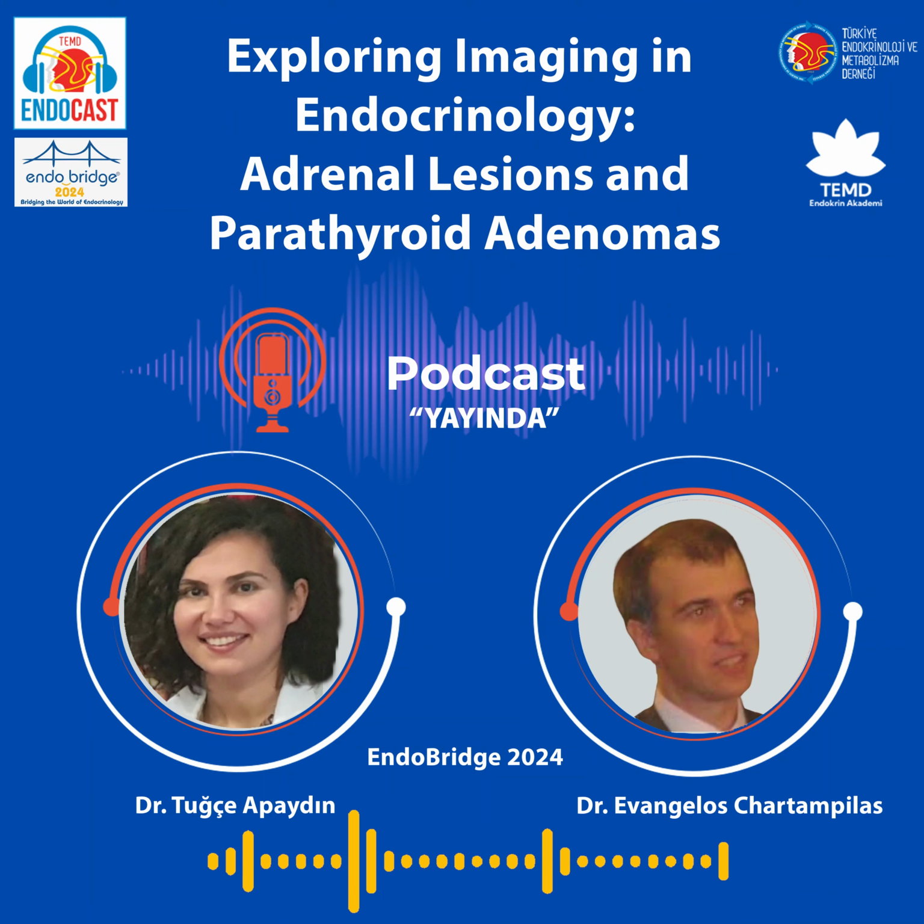Now, things are getting more difficult if the lesion is more than 30 or 40 Hounsfield units. Then it's very difficult to say it's an adenoma. It can still be, but above 30 Hounsfield units, there's no need to perform MRI because MRI will also be non-diagnostic. You will not have signal dropout. You may perform a dynamic CT, seeing if there's washout, but again, sensitivity drops. So for more than 40 Hounsfield units, I think the best approach, if the lesion is less than 4 centimeters and the patient has no clinical symptoms and no history of malignancy, is a follow-up CT or MRI scan in 6 to 12 months.